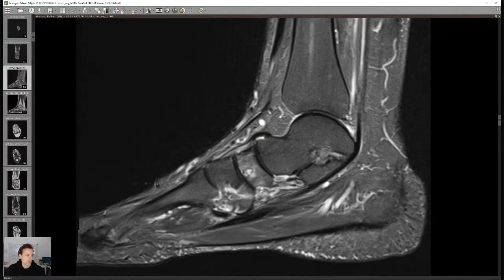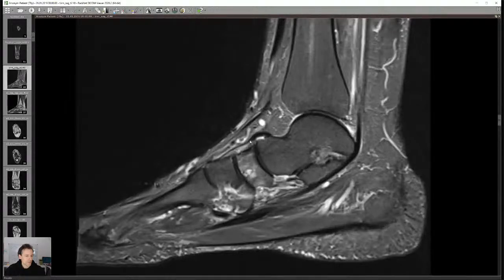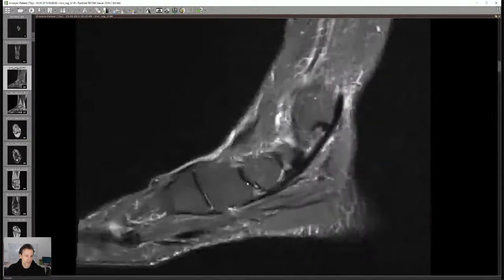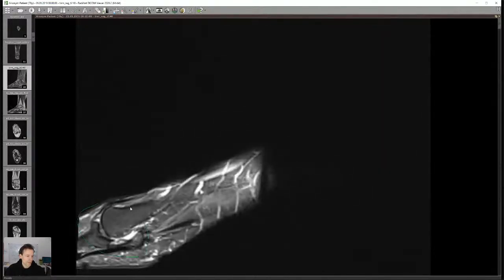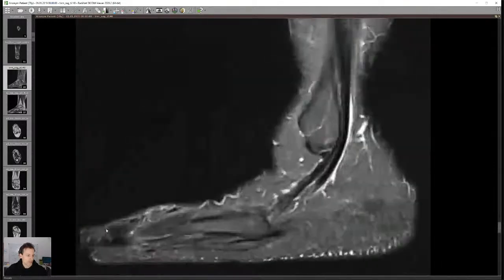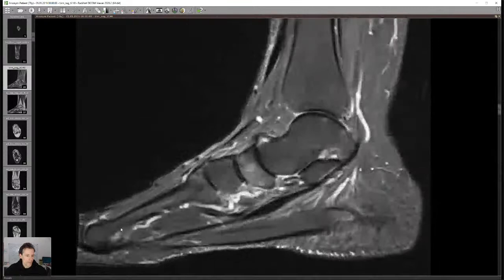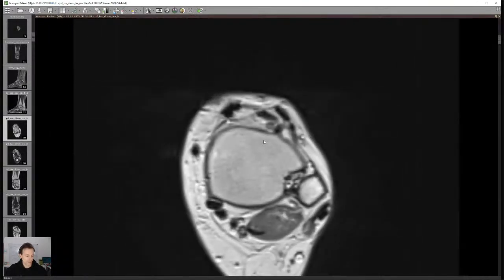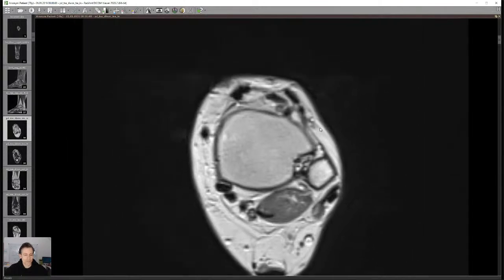Hassan is asking how to evaluate the spring ligament. Let me finish with the bones quickly — some osteoarthritis here, not very significant. Don't forget to look at the most anterior portions of the foot; you can sometimes see stress fractures, osteoarthritis, and the lesser toes. Moving on to the ligaments, I gave a lecture on the spring ligament at last year's Radiopaedia conference.